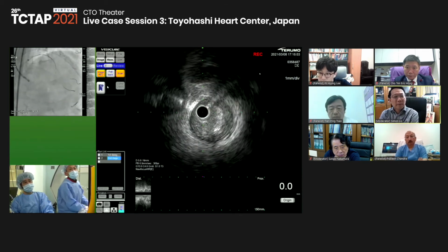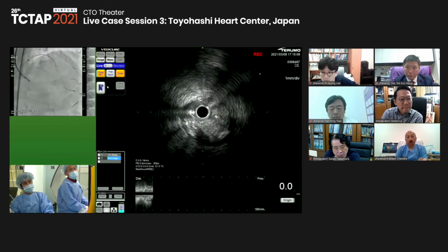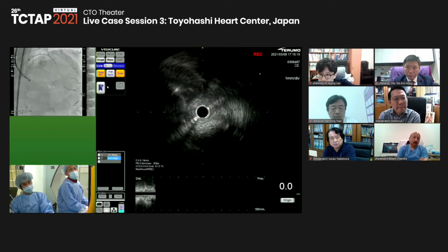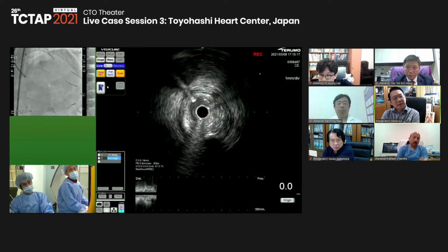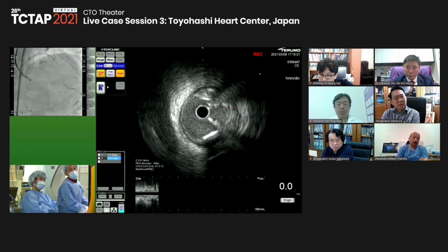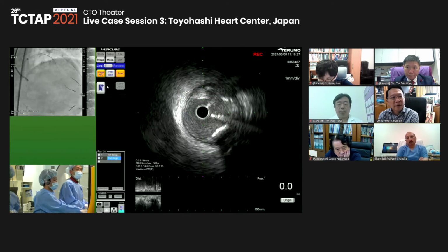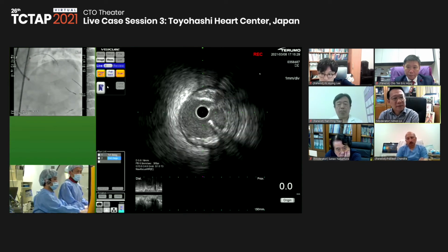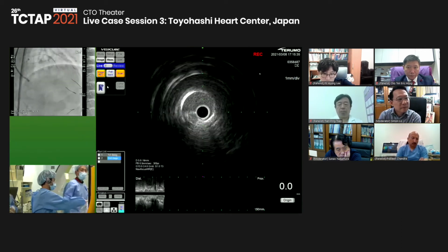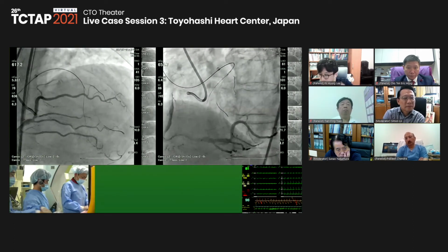Yeah. So this is the second diagonal now. You can see some small calcification, but almost fibrous plaque is there. And then this is the first diagonal. Yeah. So we needed the stent around here, but the discrepancy between the distal and the proximal LAD is one of the issues of this kind of case, right? Yes. So anyway, we need a small balloon dilatation for the second and the first diagonal before stenting.